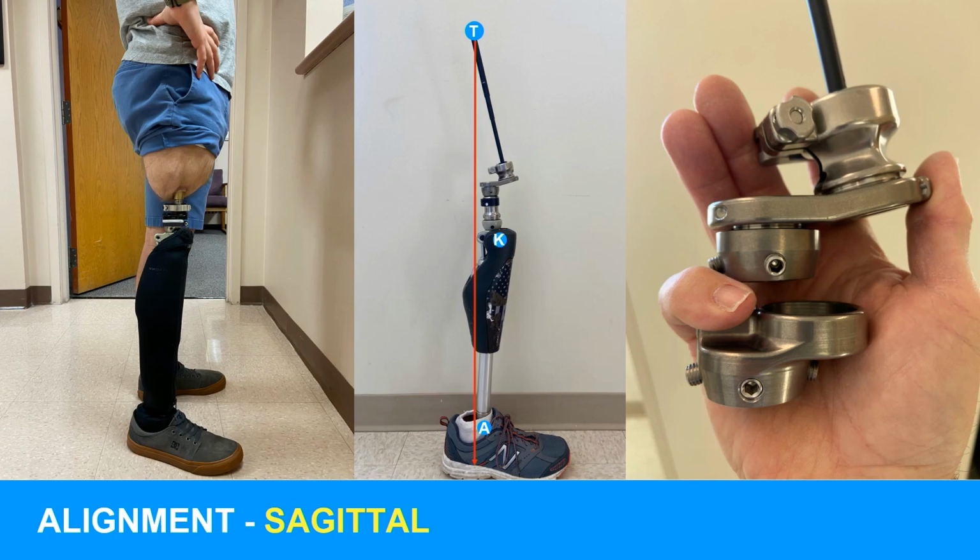So we're seeing a huge contracture that has to be reduced, but we have to accommodate it initially, and as Dr. Stoneback said, accommodate it minus a little bit because we want them to extend, we want that contracture to reduce. Guess what though, we're missing a socket, and it's very hard for prosthetists to look at our alignment. I simply take a Thomas test, a flexion angle, and there's nothing more magical than putting a digital goniometer on an implant.